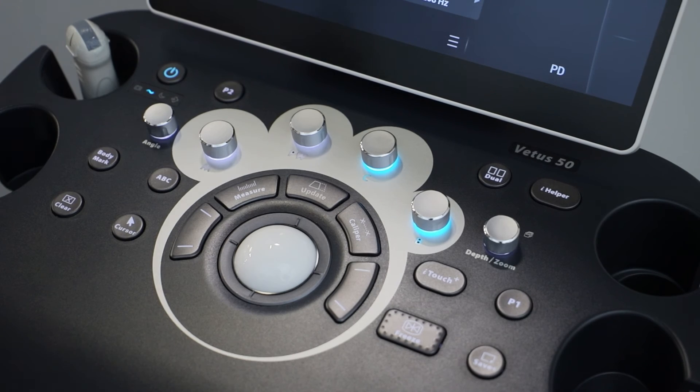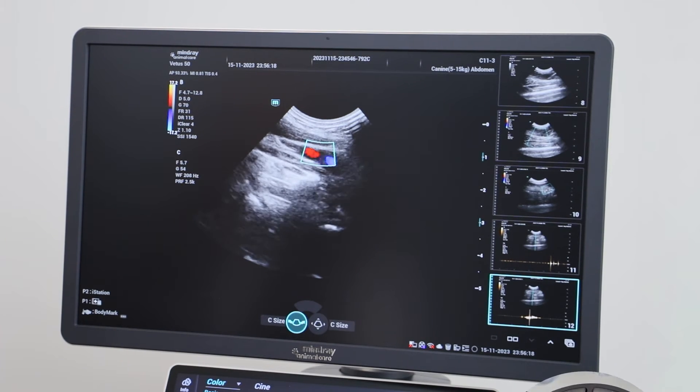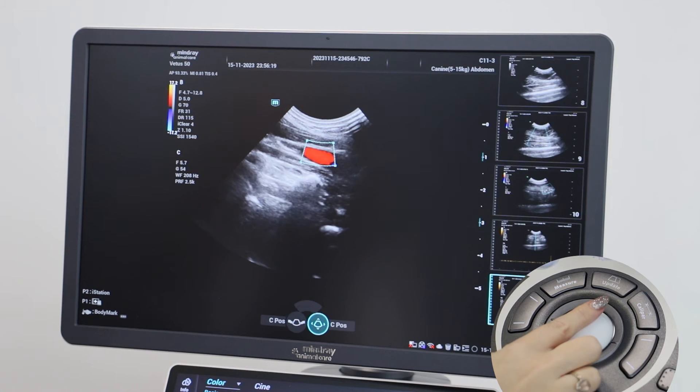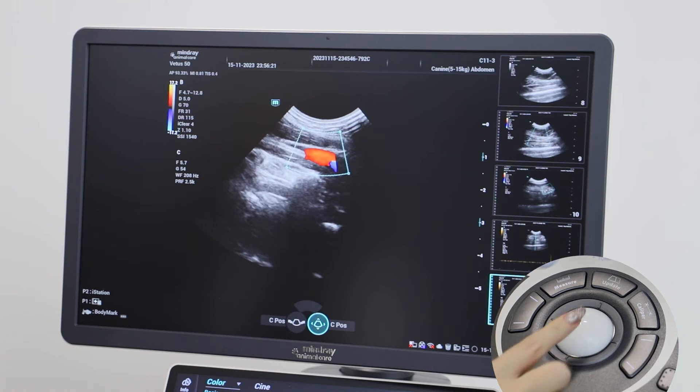Color Doppler can be controlled in the same way by just pressing the C dial and then adjust your window as previously described.